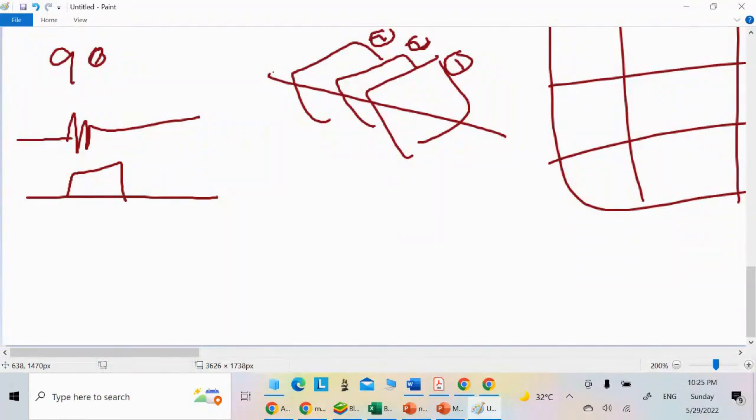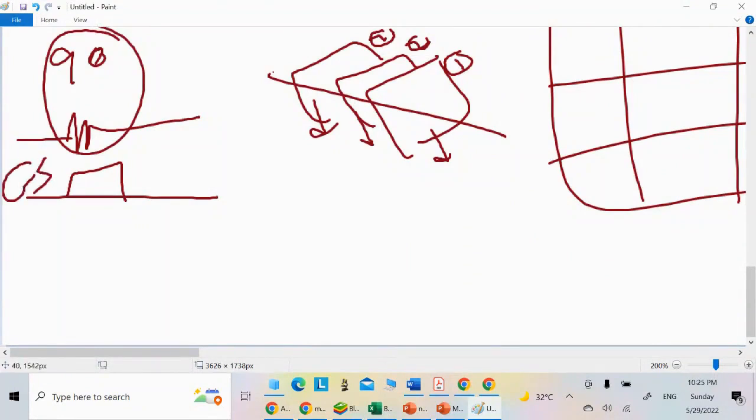If the brain is excited, how can I make slice 1 rotate at a different speed than 2, which is different from 3? So when I give the 90-degree pulse, I give it at a frequency corresponding to what I want to work on. This is the slice selection gradient.